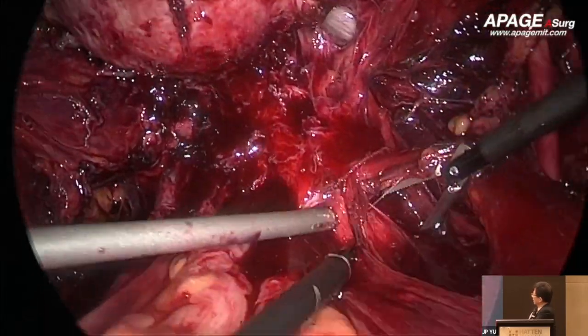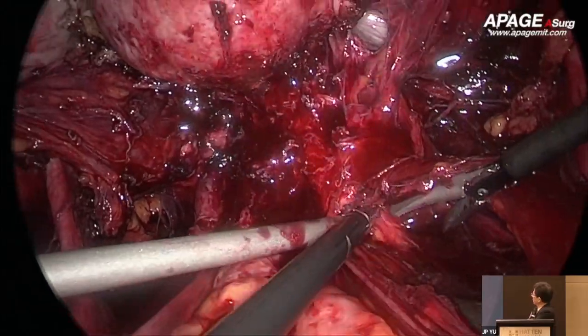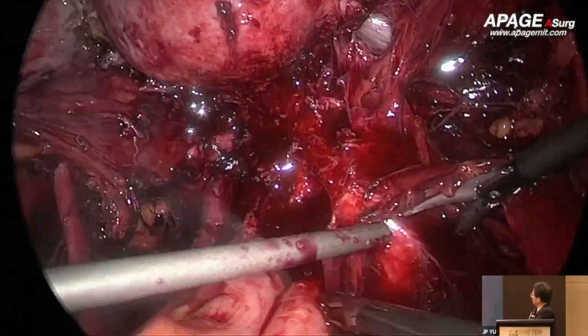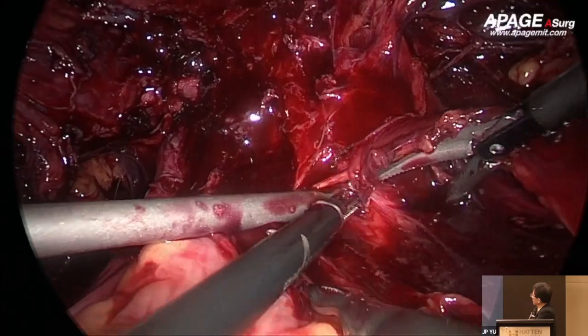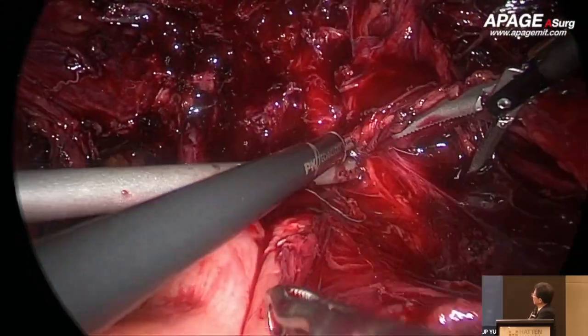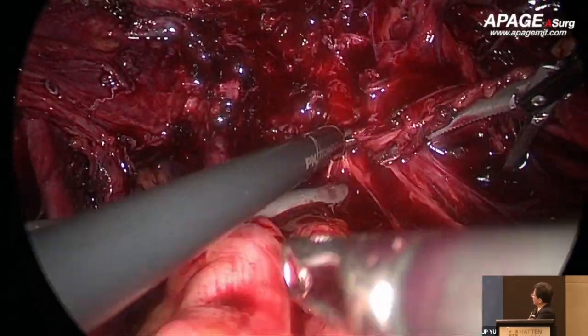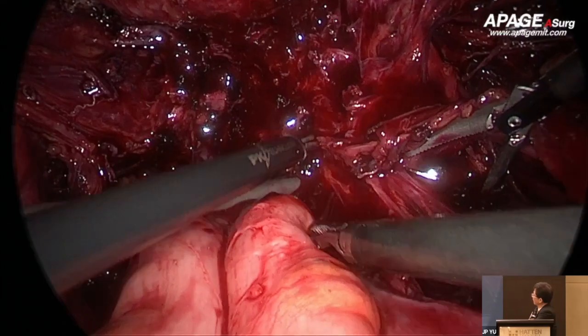Okay, here, the columns is here. So the uterosacral ligament will be here. The uterosacral ligament will be here. Ureters adhere to the uterosacral ligament. So if you don't identify the ureter, then you cut it, then the ureter has been cut.